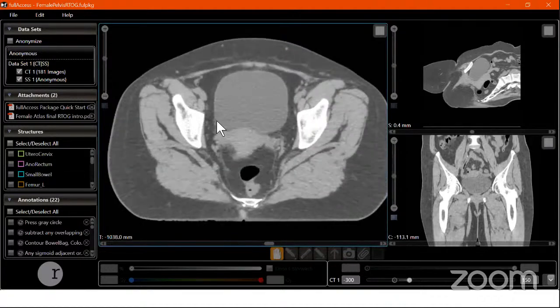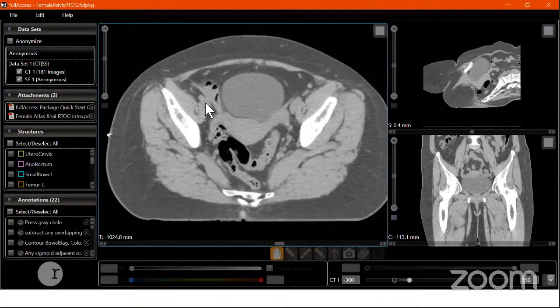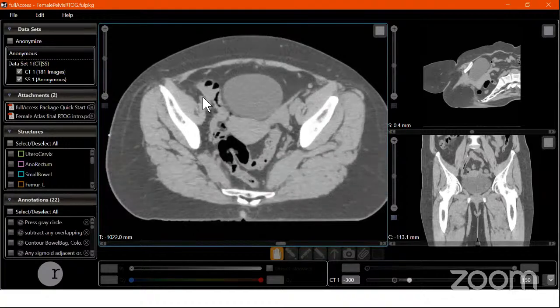There are some guidelines that say we need to provide a 1.5 centimeter expansion laterally on the external iliac group. Again, that is controversial because it adds only about 1% additional chance of capturing the lymph node, but it will increase the chance of bowel doses significantly. So we are quite safer in avoiding that 1.5 centimeter lateral expansion from the external iliac than including it.